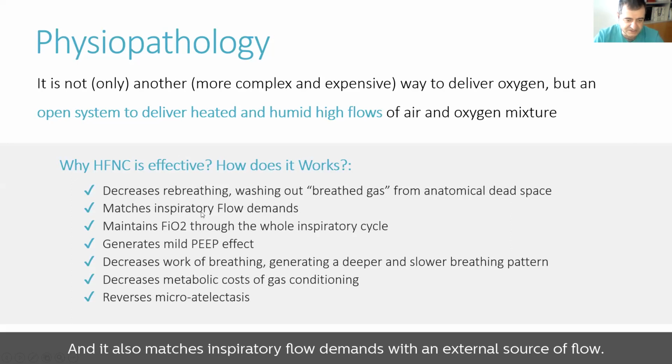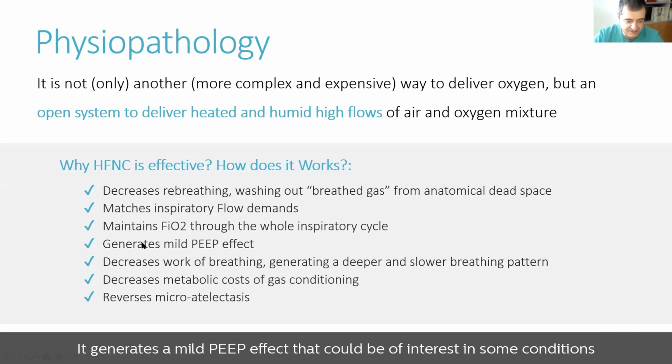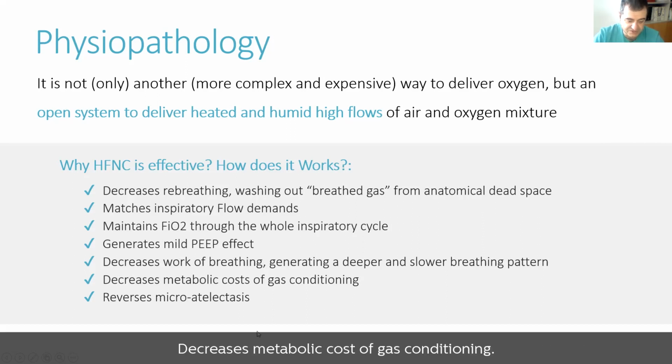It also matches inspiratory flow demands with an external source of flow, maintaining FiO2 through the whole inspiratory cycle. It generates a mild PEEP effect that could be of interest in some conditions, such as cardiogenic pulmonary edema, decreases work of breathing, generating a deeper and slower breathing pattern, decreases the metabolic cost of gas conditioning, and reverses microatelectasis.